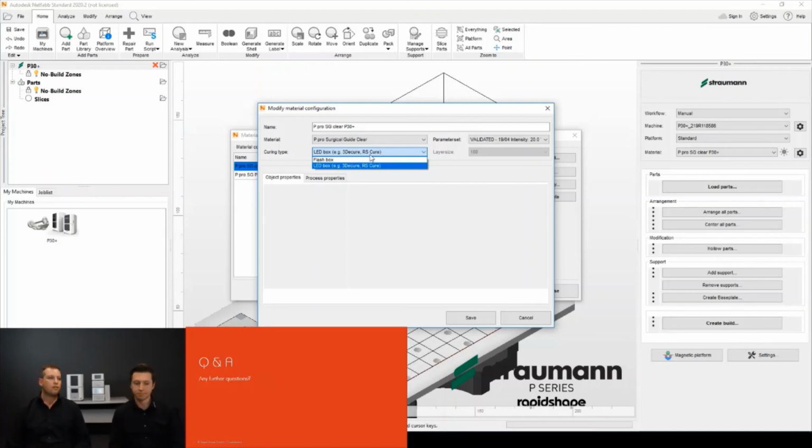That's because if you're printing at the same time with the same shrinkage, then this won't affect your finished product. But you can imagine that if you're printing with printer A using the wrong post process and then printer B with the correct post process, these parts might not fit as securely as you'd like them to. So the easiest explanation is just use it with the same curing machine you selected. So there's no issue even in show and tell if you want to show, for example, that the stump from this machine is fitting into the model of the other machine. Yeah, that's very important.